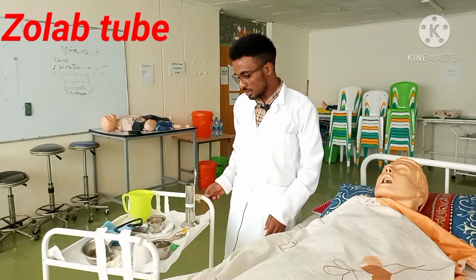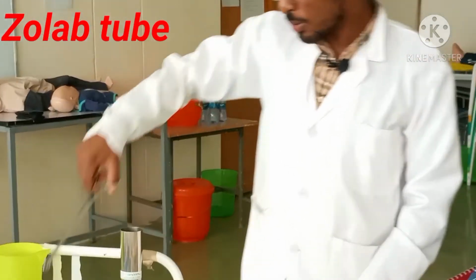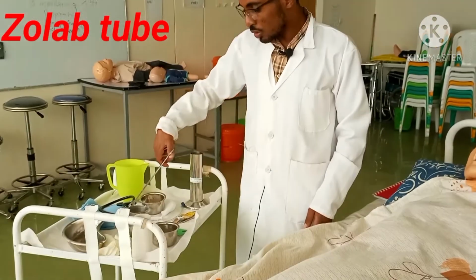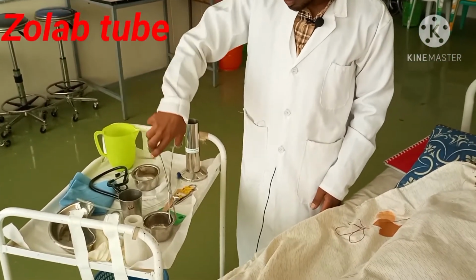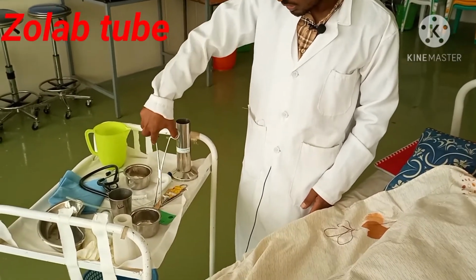Here are the necessary equipment to insert a nasogastric tube for a patient. Firstly, we need an appropriate sized nasogastric tube. Here is a nasogastric tube. We need also a stethoscope, a straw or a glass of water, a gallipot, a gauze. Here is also a tongue blade.